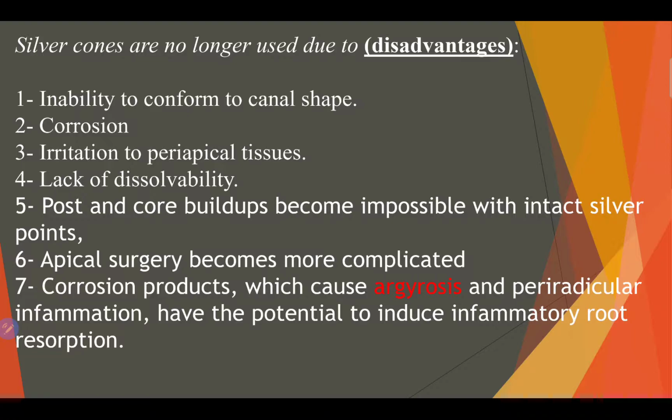Post and core build-up become impossible. That's obvious because we cannot insert any post in a root canal with a silver cone.